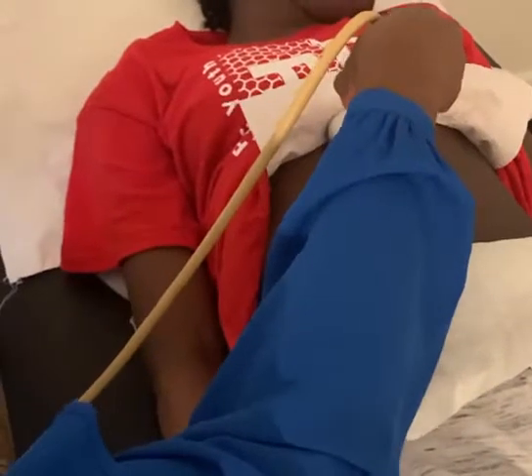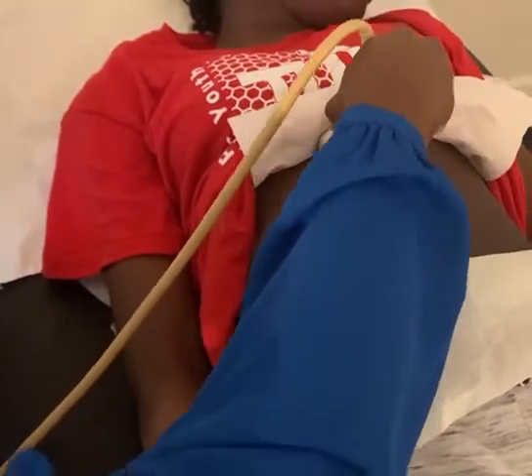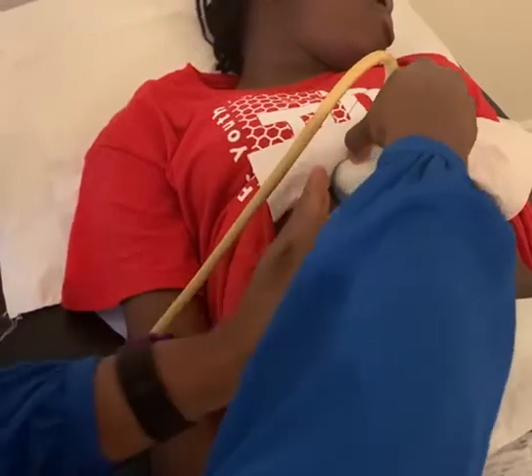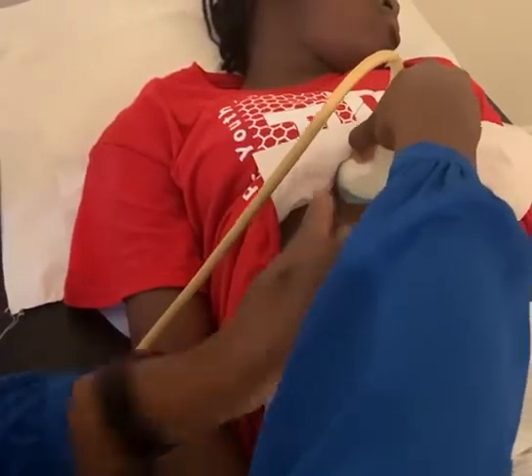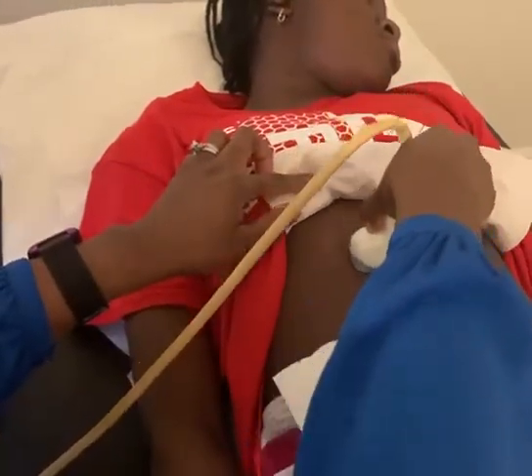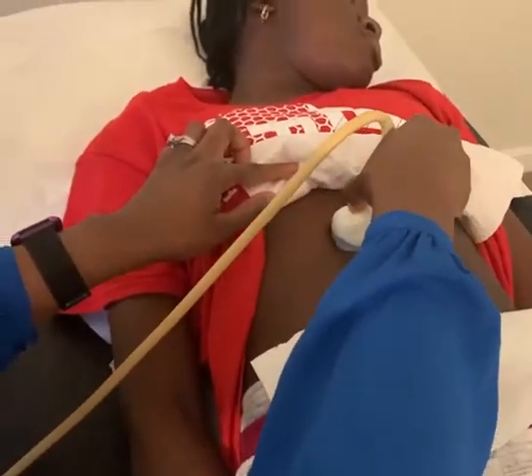Today I have a very young model with me here and we're taking a look at the aorta. I'm going to start all the way at the proximal segment. Usually your aorta runs right in the mid-abdomen, and just looking at this segment and following it down, you should be able to track your aorta all the way down.